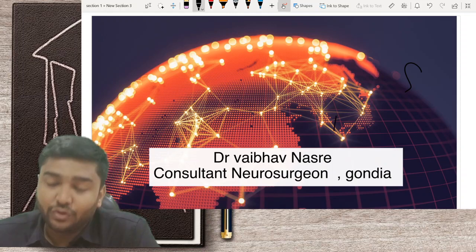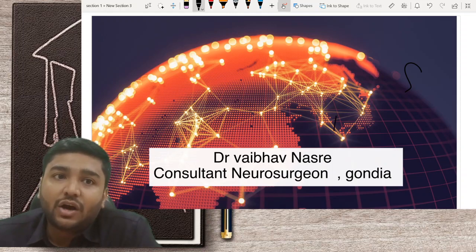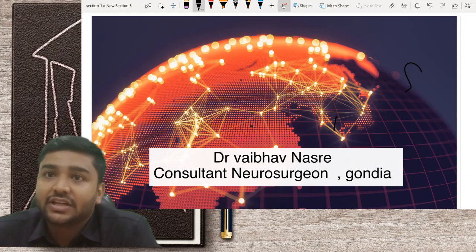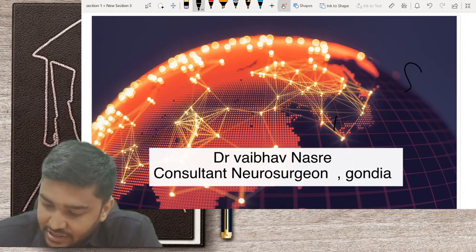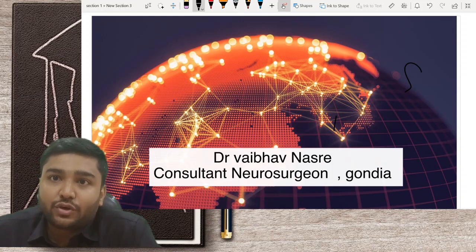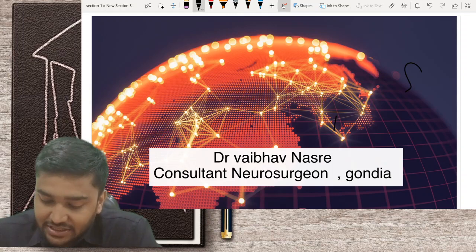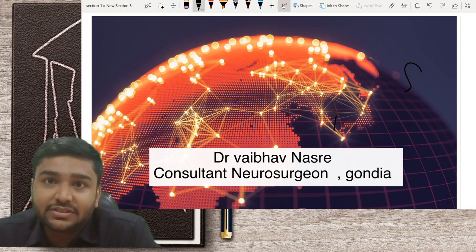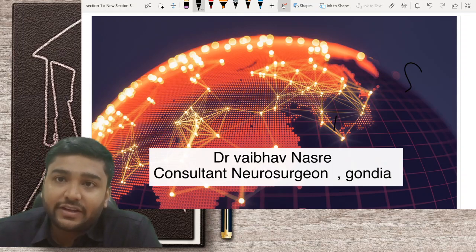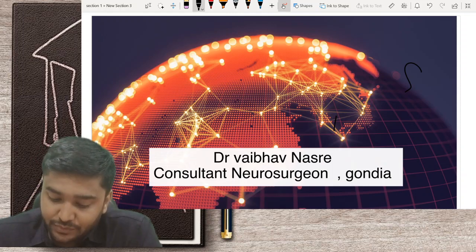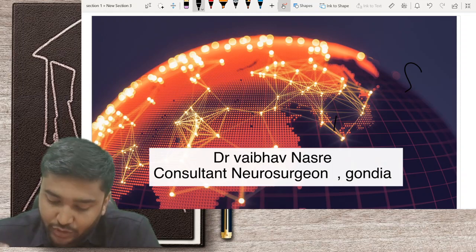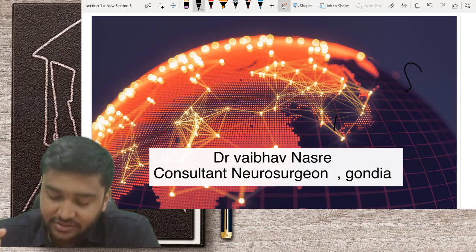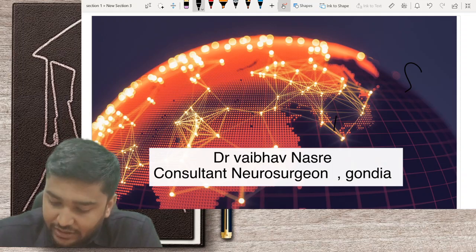I am going to show a series of CT scans — how to read them, how to arrive at a clinching diagnosis, and how to manage further. We will keep it a short video covering the most common entities in neurosurgical practice, which we see on CT scans regularly.